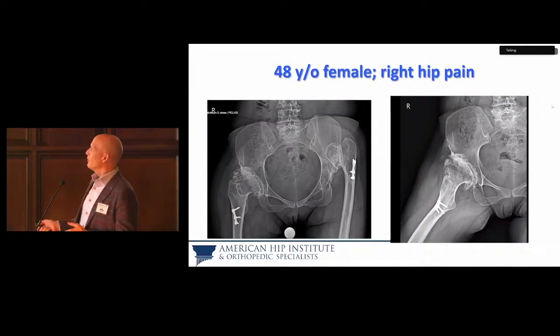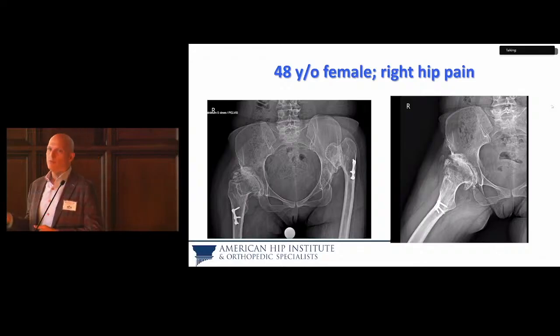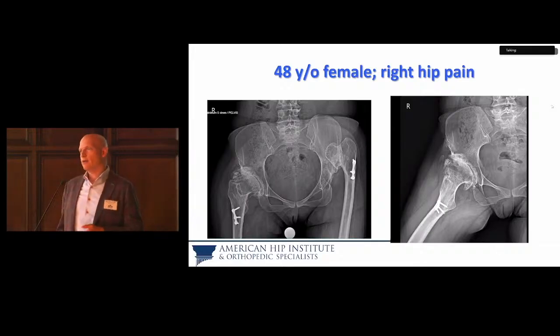A little bit more complex patient here. You may be thinking I'm doing this side. This side actually isn't causing her very much pain, at least it wasn't at the time. We're going to do that side in a few weeks, though, just to balance her out. We started with her right side here.